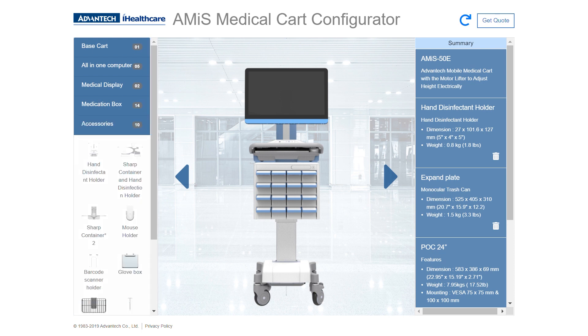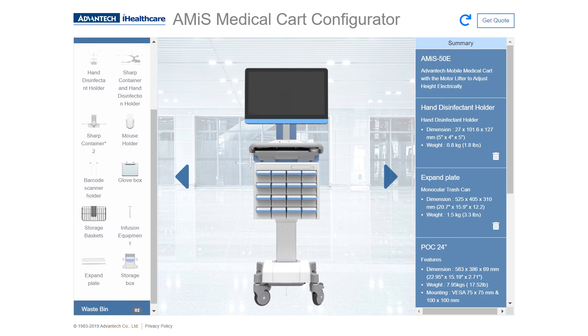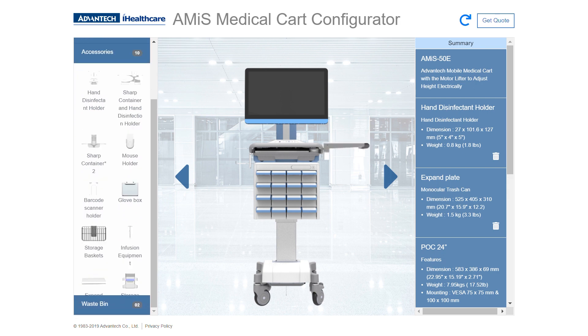Next, let's add some accessories. For example, a hand disinfectant holder — let's put that on the left. And let's say you want a little more real estate; let's add an expansion plate on the right.